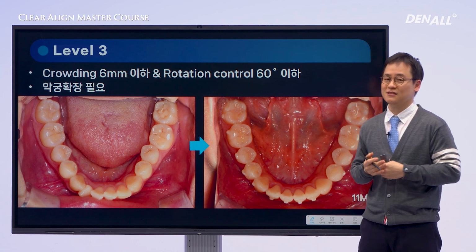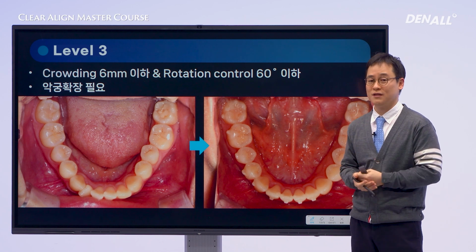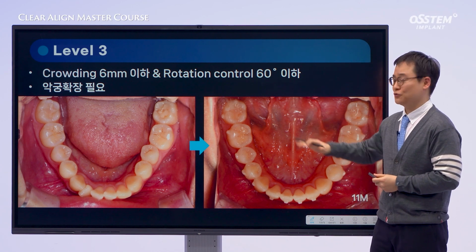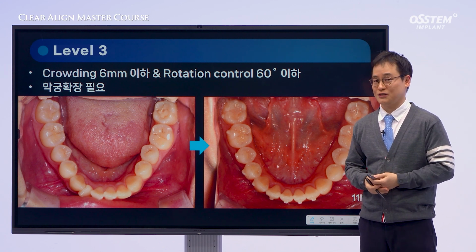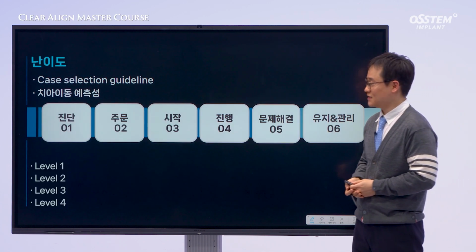Of course, there could be level 4 or even level 5 cases. But for beginners, I recommend focusing on level 1 and 2, and then you can achieve good outcomes. As for level 3 and 4, it's better to approach them after gaining more knowledge and clinical experience.